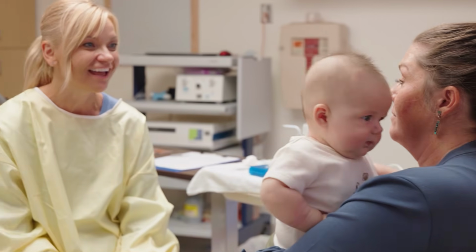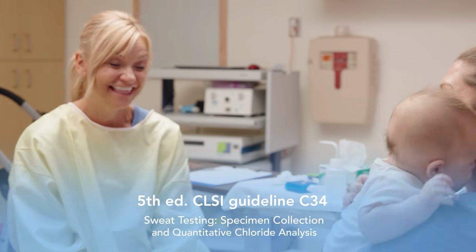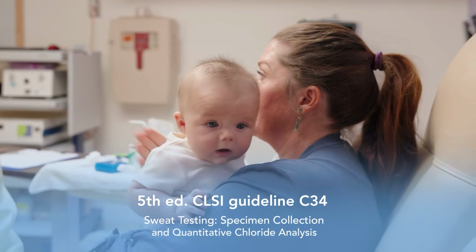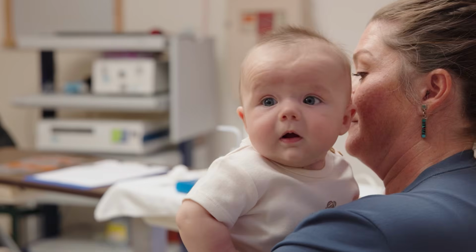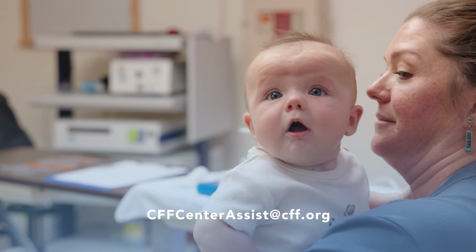For additional information, refer to the 5th edition of CLSI Guidelines C34, Sweat Testing, Specimen Collection, and Quantitative Chloride Analysis, and follow the manufacturer's recommendations for your equipment within the user manual. You can also email CFF Center Assist at cff.org with any further questions.